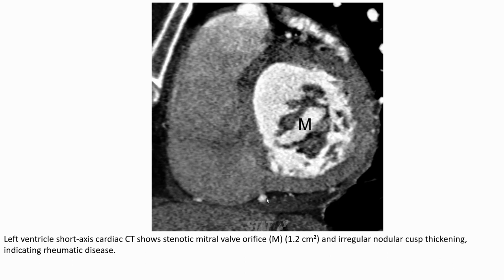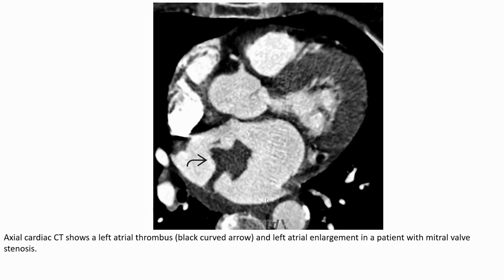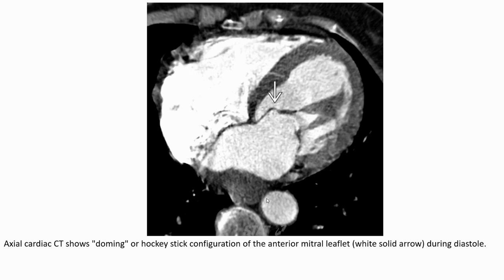This CT-A may show a stenotic mitral valve orifice with an area of around 1.5 cm². Irregular nodular calcific thickening is noted indicating rheumatic changes. This CT-A may also show a left atrial thrombus indicated by the black curved arrow, and left atrial enlargement in the patient with mitral valve stenosis. CT-A may also show doming or hockey stick configuration of the anterior mitral valve leaflet during diastole.